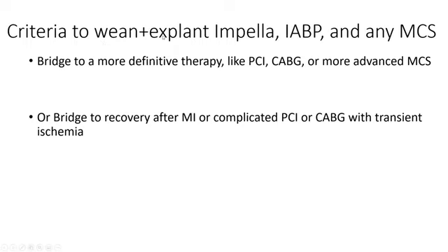So how to wean and when to wean balloon pump. So keep in mind whether balloon pump or other mechanical circulatory support, they have two big uses. They are bridges to two things, either a bridge to a more definitive therapy like PCI or CABG or more advanced MCS.